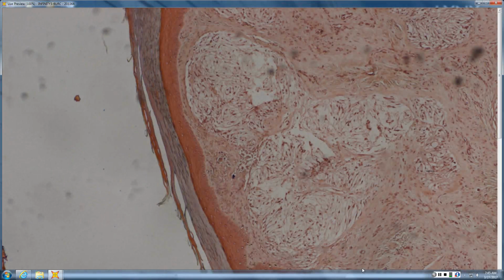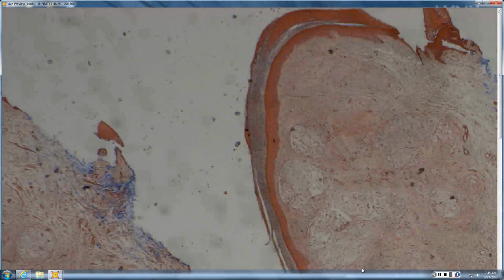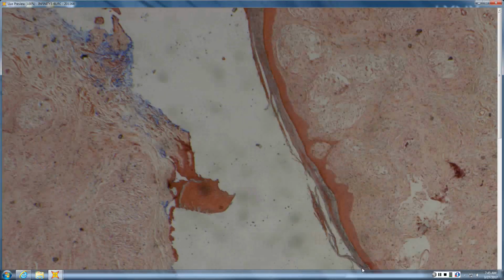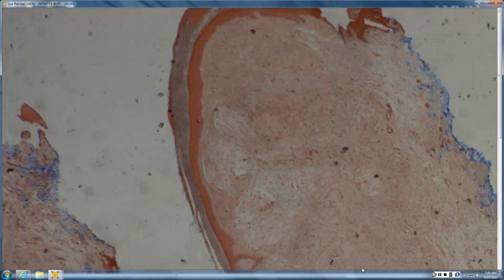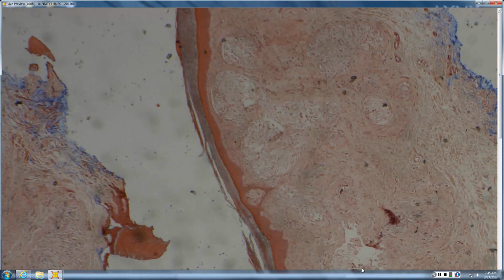Looks like acral skin. I mean, think about that accessory digit. I mean, I think I'm seeing nerve tissue in there. So looking, you see something that looks neuroid. Is it A, well-defined, mature-looking nerve in fascicles, or B, myxoid pools with stellate nuclei? So the latter, myxoid. So shockingly, it's the second choice, right?